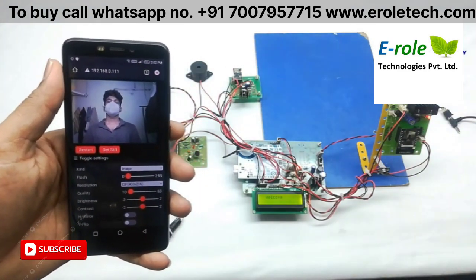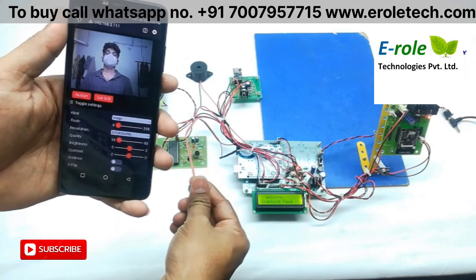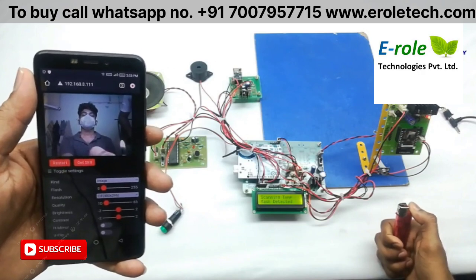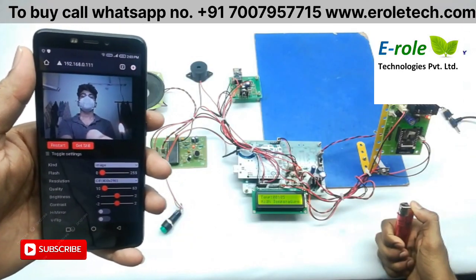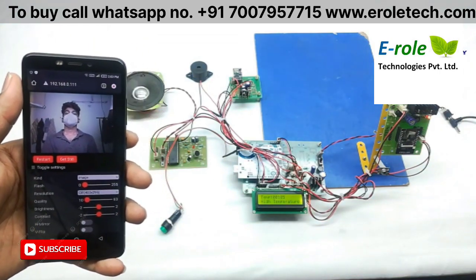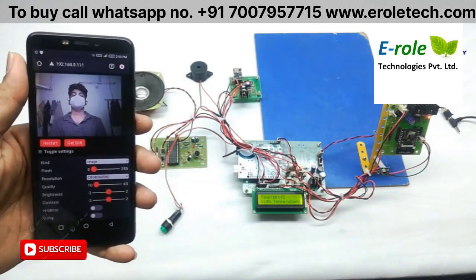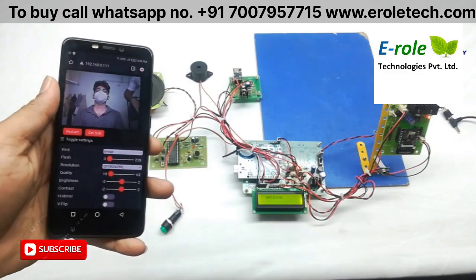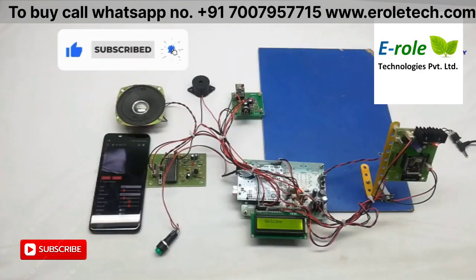And the third condition is with mask in high temperature. Temperature 105. Will not allow. High temperature. Now we will open the server.